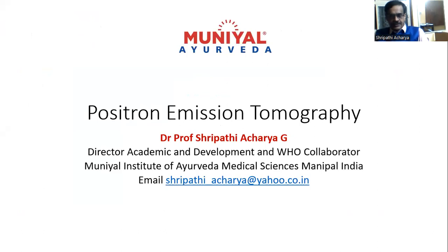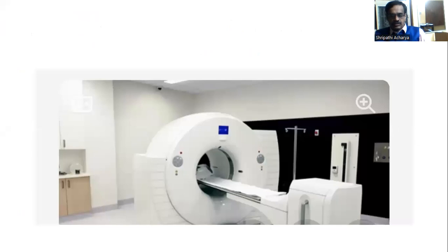Today's topic is positron emission tomography, or PET scan. This is the advanced technique where you can measure the pathologies in the soft tissue. This is a machine.